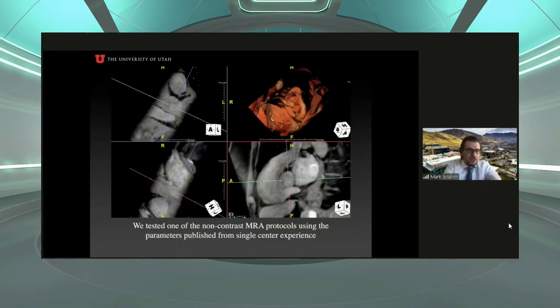Well, we took their measurement and applied it to our patient population, select patients referred to our TAVR clinic with chronic kidney disease. Unfortunately, especially when we used it on a 3 Tesla scanner, the image resolution was pretty low, and we could not confidently measure this. When I showed it to Dr. Tandar, he took it with a grain of salt.